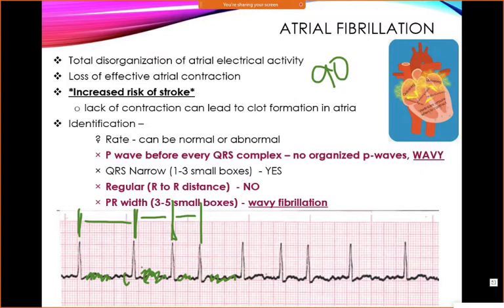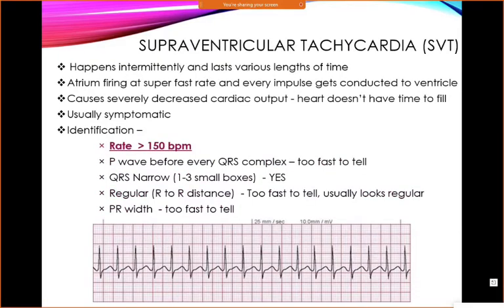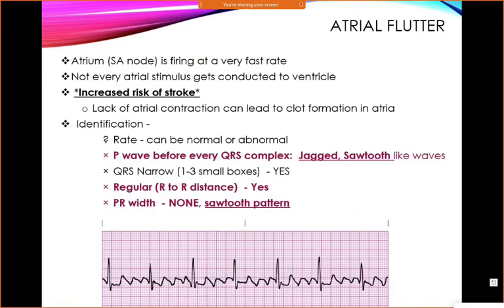This one is atrial flutter, and this could be called atrial tachycardia. This is the atrium, so you're like, okay, this is a P wave. Oh, let me go back. I keep going to draw, and then it forwards my screen instead. So you're like, okay, this is a P wave. This is a P wave. This is a P wave.